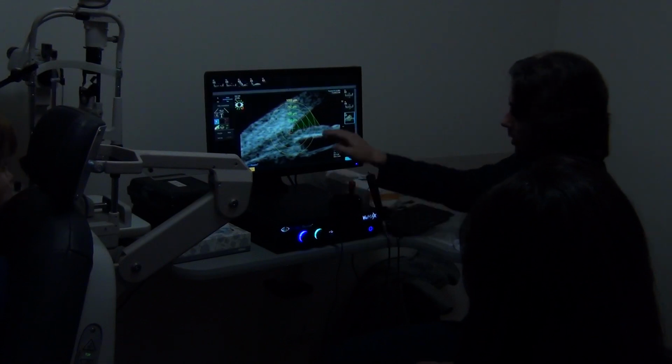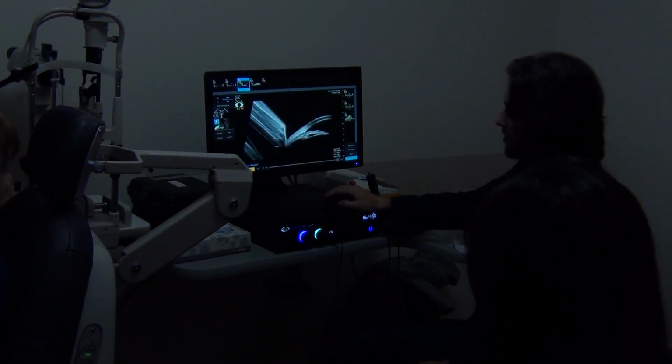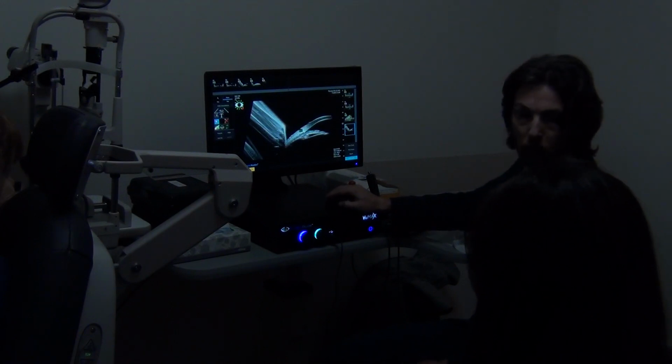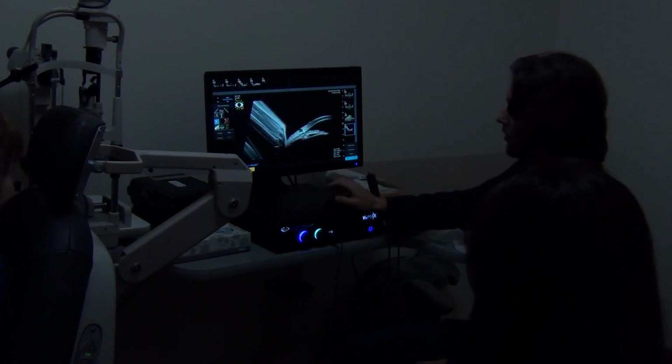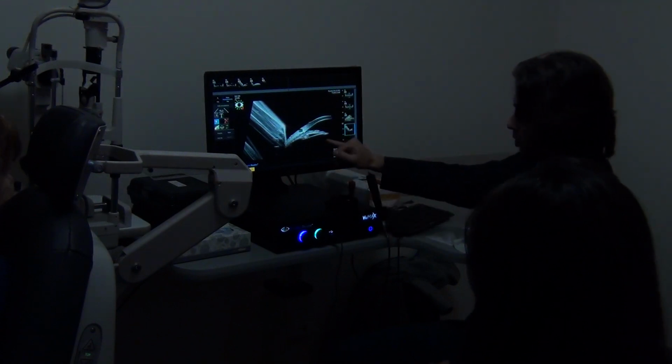I don't know if in Quantel you had this algorithm. No. You probably would have to just manually do the angle, right? So you would probably take this regular angle and wander around with it, which is still okay, it still provides you the information. But I think that professional tool is much more valuable and gives you more data. All you need to do is just identify the spur and the unit will do the rest for you, as long as the picture is fine.